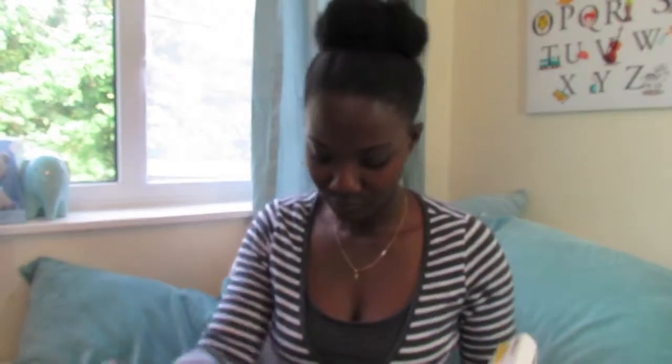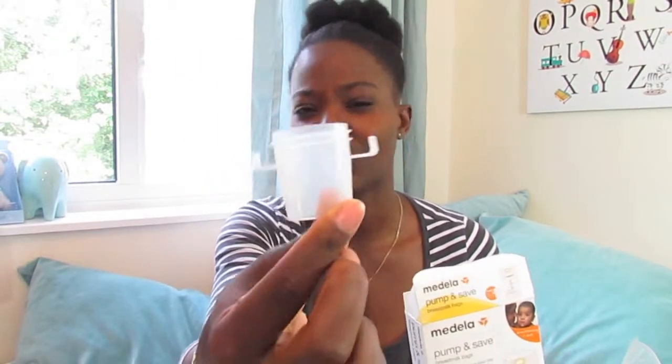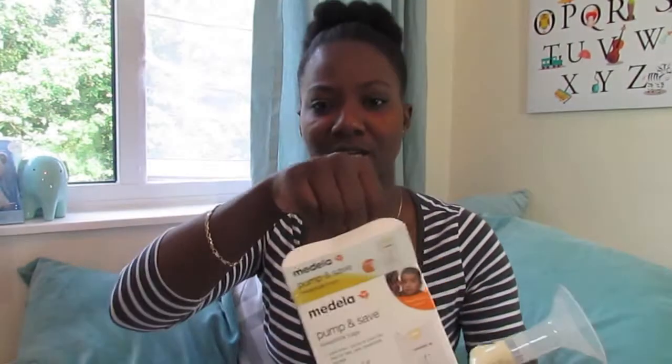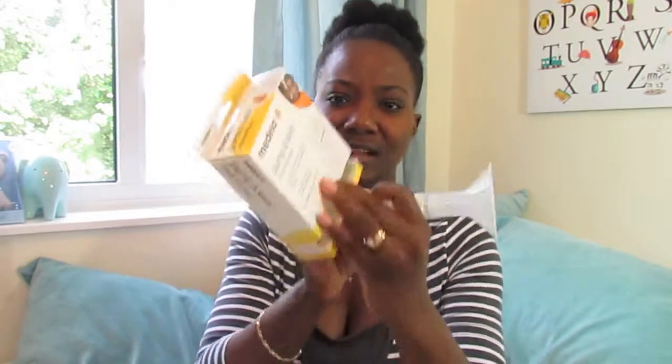Another thing I'll share is these breast milk storage bags. I had some Medela storage bags — these are ones I re-bought, because the ones that came with my bundle actually had a tape so you'd tape the bag over the pump handle when pumping. I loved those but used them all. The ones I repurchased come with a connector instead to hold the bag over the pump. I didn't use these very much, but I do like storage bags because they're easy to store in the fridge and don't take up as much space as a bottle.